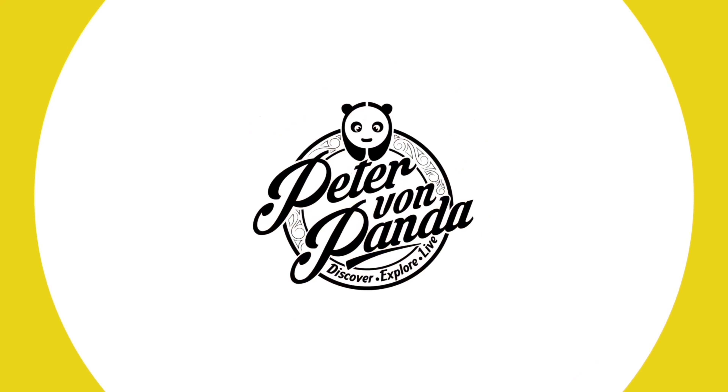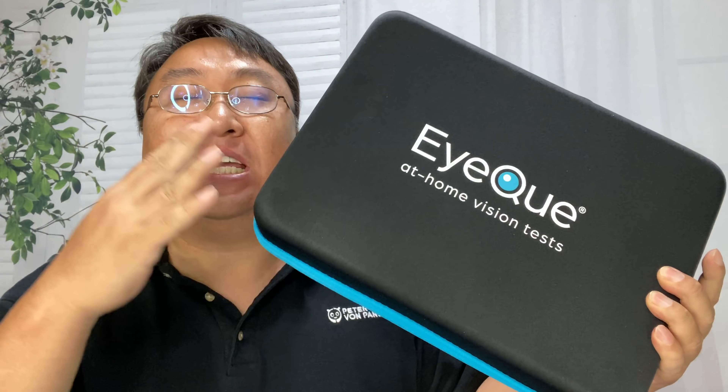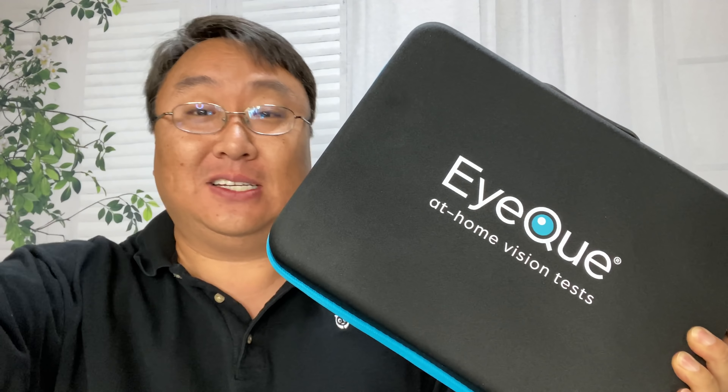You can give yourself a vision test at home with this. What's happening, Panda Nation? Peter Von Panda here. I just found something that is amazing — this thing is actually a game changer for people that wear glasses.